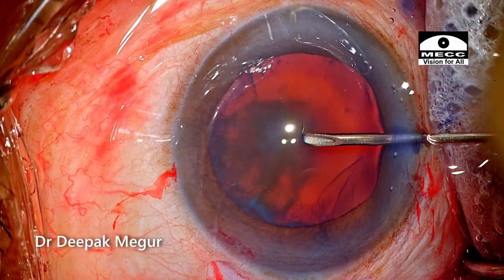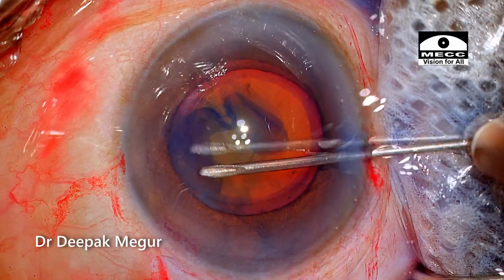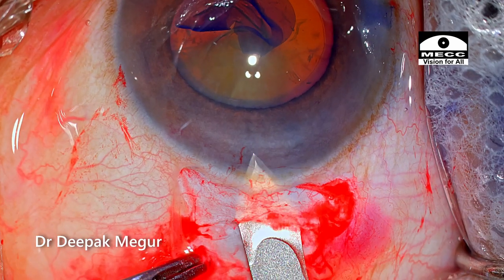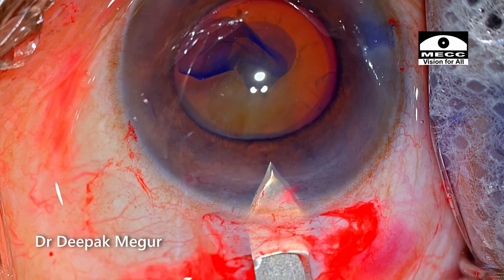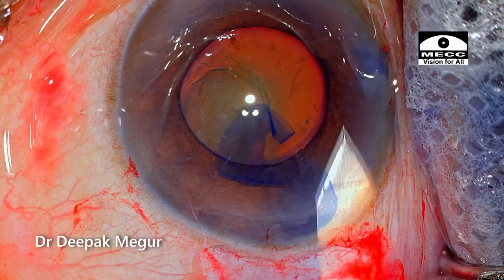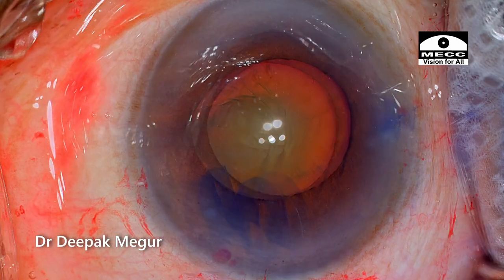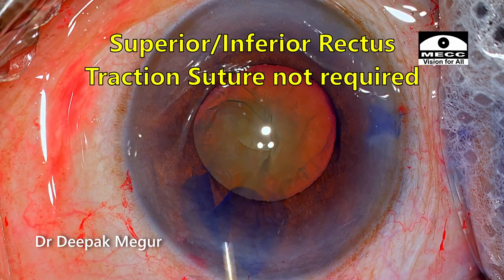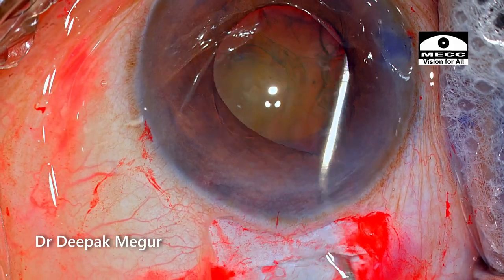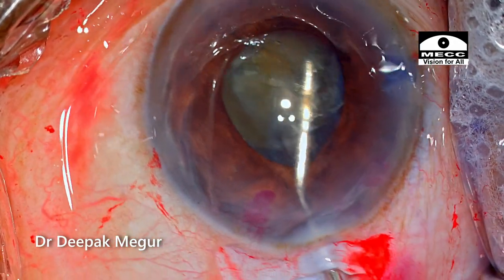The rhexis is first completed under the cover of OVD. After that I am going to enter the anterior chamber through the main wound. While creating the internal incision, care is taken to ensure that the inner lip runs always parallel to the limbus, ensuring the valve functions very well. These wounds are very strong and ensure very good refractive stability post-operatively. I get asked quite a lot how we can perform SICS without a traction superior rectus suture — as you can see, we are using none. I don't use traction sutures in the majority of cases; it's not required at all.